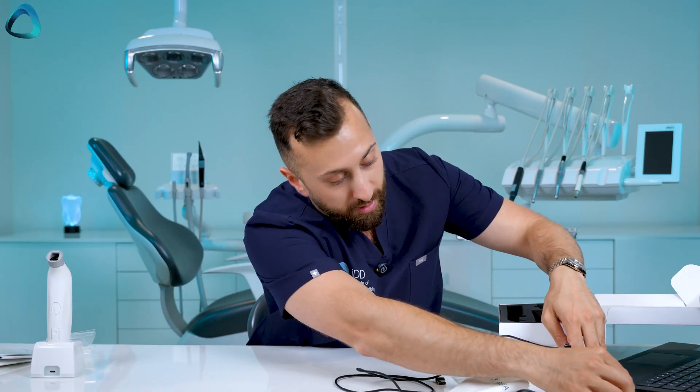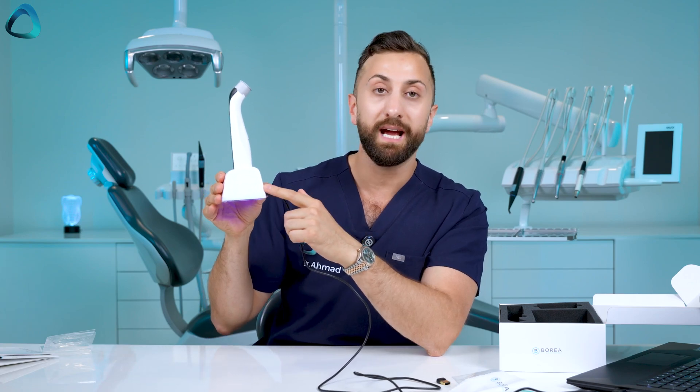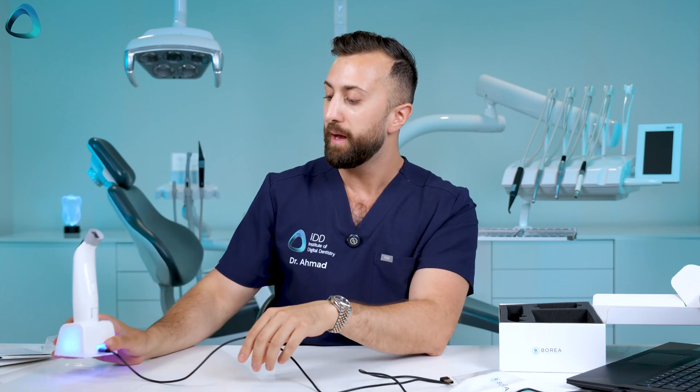Setting this up is pretty straightforward. First, connect the charging station to your computer using the included cable — USB-A into your computer, USB-C into the back of the charging station. You'll see a blue LED light up, confirming it's connected and charging. Next, take one of the autoclavable scanning tips and clip it onto the Cobra — it clicks into place, and the device is now ready to take a shade detection.